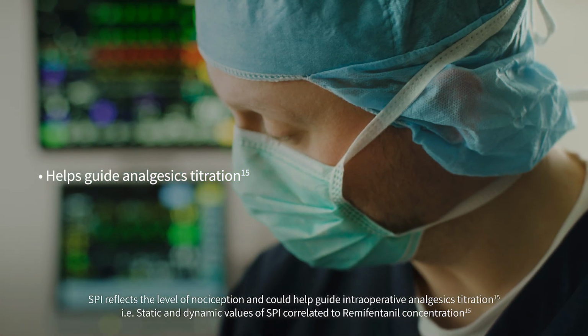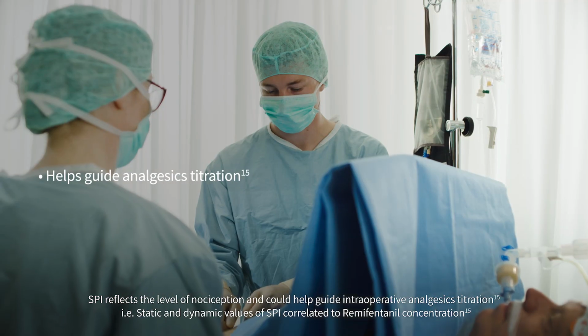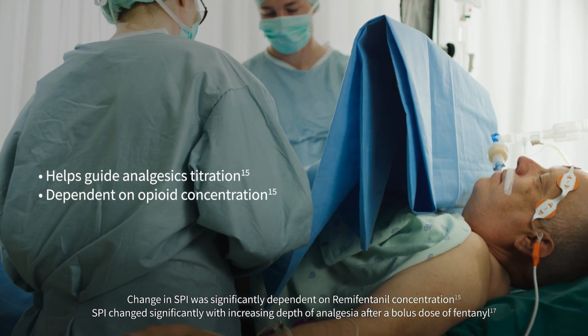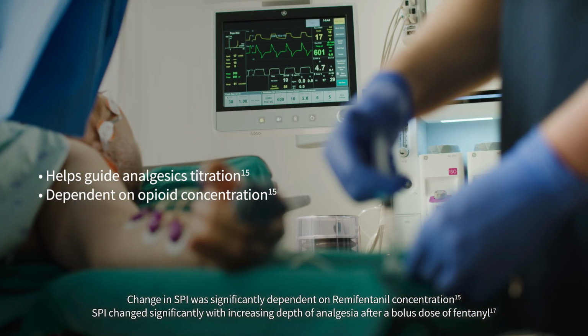For example, static and dynamic values of SPI correlated to remifentanil concentration. Change in SPI was significantly dependent on remifentanil concentration. SPI changed significantly with increasing depth of analgesia after a bolus dose of fentanyl.